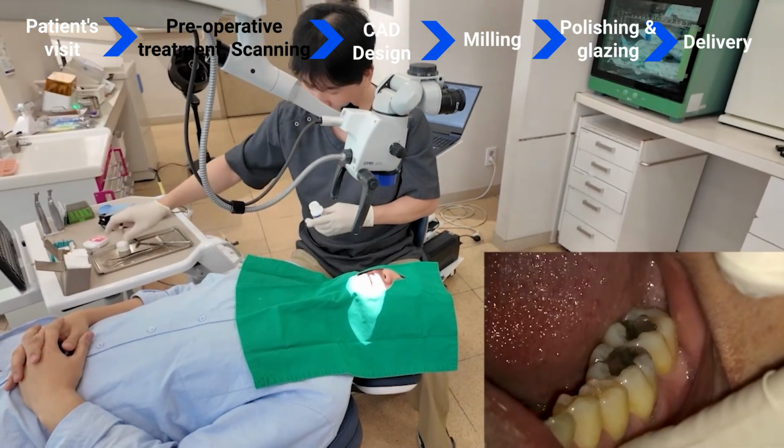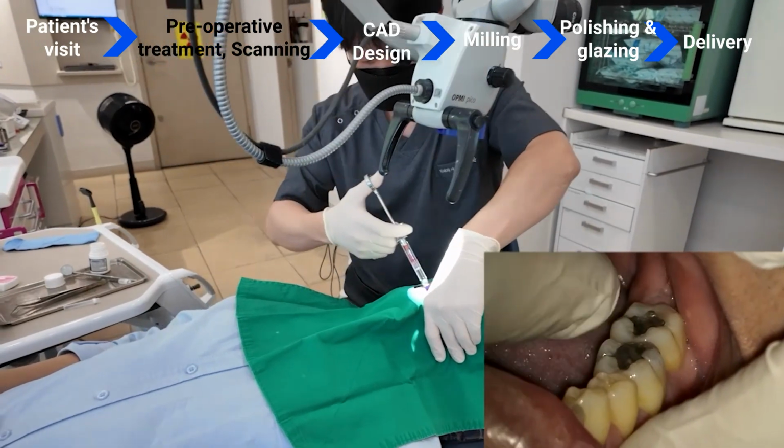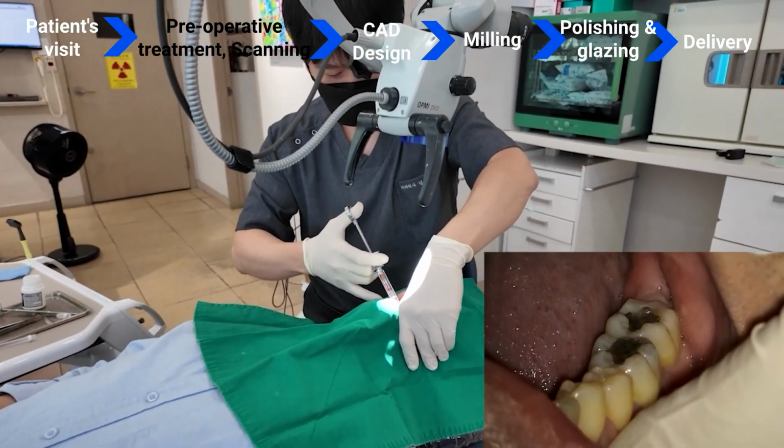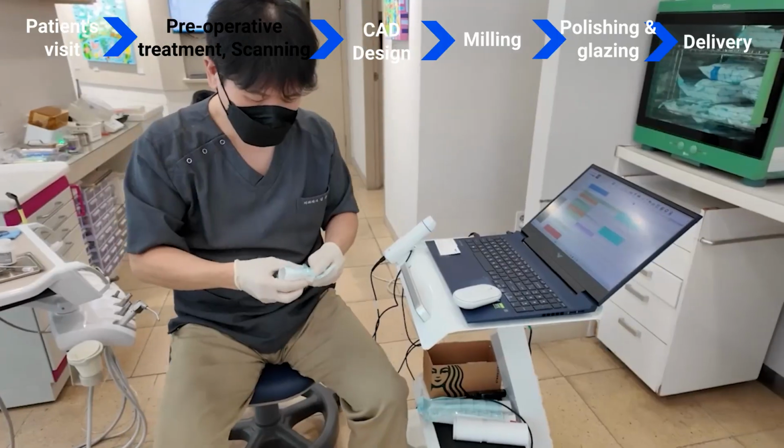With the area identified, it's time for anesthesia. A little topical numbing followed by a block injection ensures that our patient is comfortable throughout the procedure.